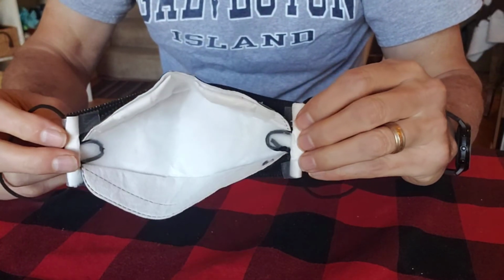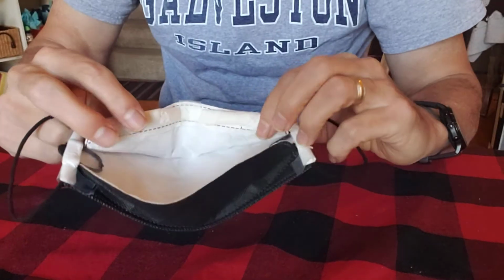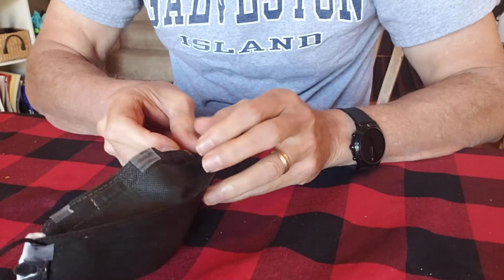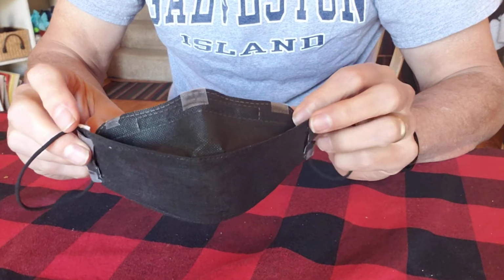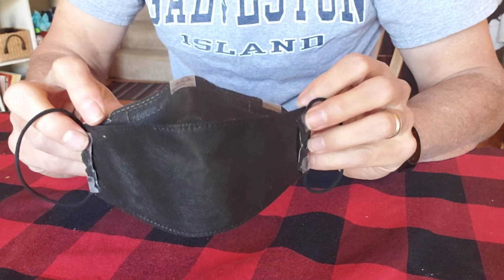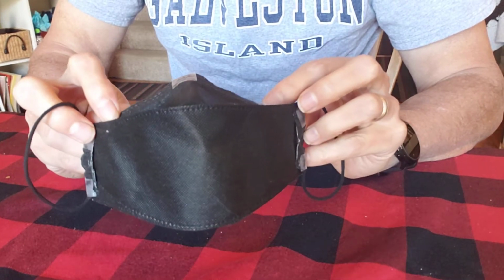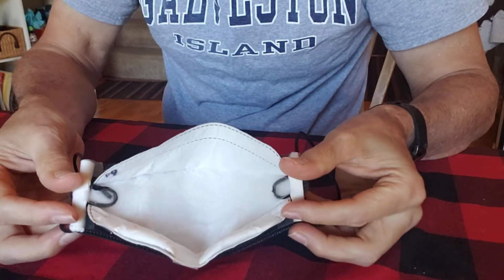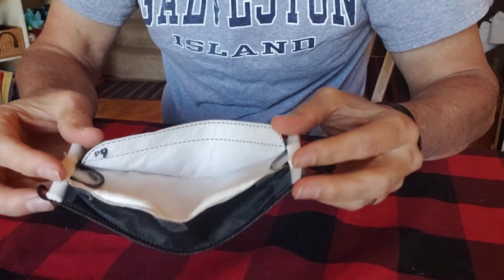This is a Bluna face fit where I've taped in one piece on each side, just like I showed. And here you can see what the tape looks like from the front. You don't really see these pieces of tape on the side because they kind of hide, but this piece on the nose, you're going to see that, but that's just life. I could have used double sticky tape, but I didn't want to mess around with that.